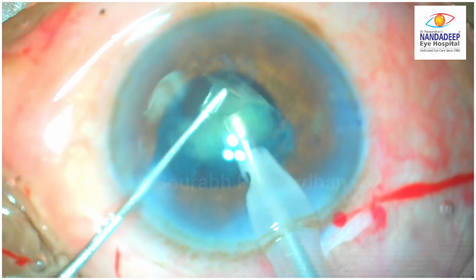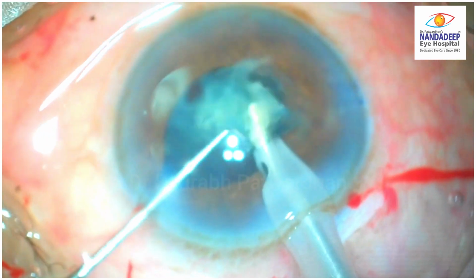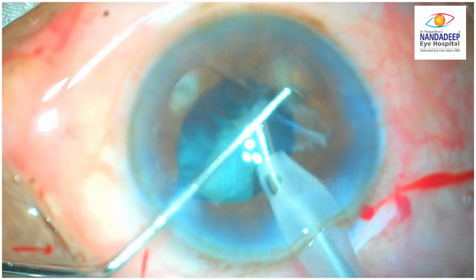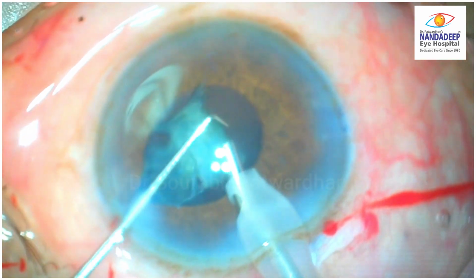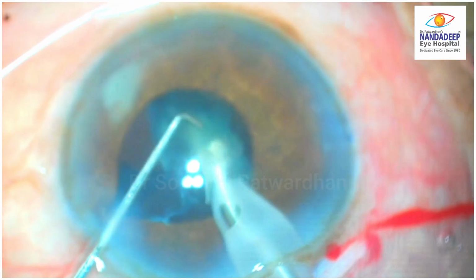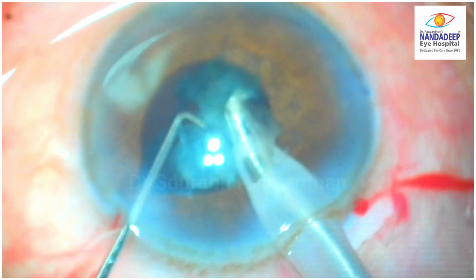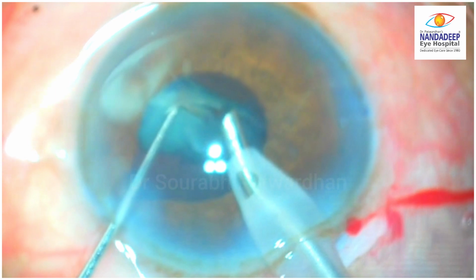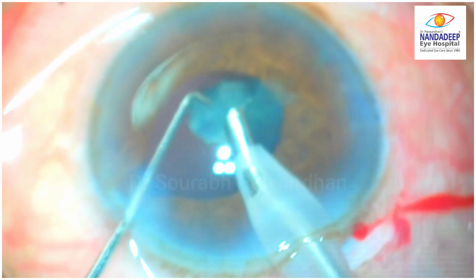Now here is a case which I want to demonstrate. One of our fellows is doing the surgery. It's a routine cataract, nothing different, but as the surgeon is getting ready for the last piece, you can see the pupil has come down a bit, and though we cannot watch this on this 2D video, the surgeon felt that the posterior capsule is coming anteriorly, so we reduced the vacuum to very minimal, 100 to 150 vacuum here, and at this vacuum the surgeon completed the last piece emulsification.